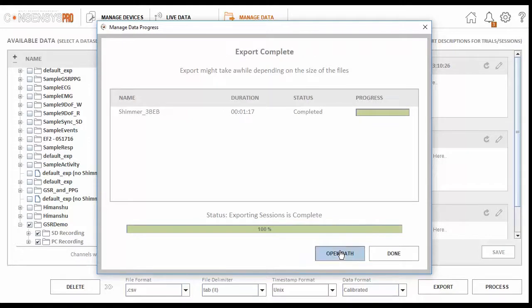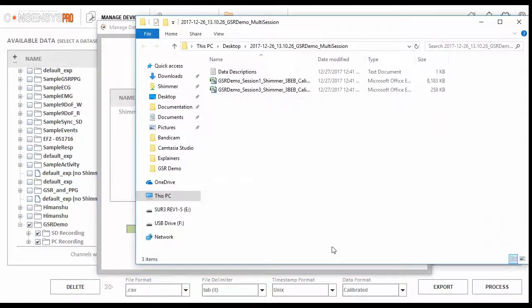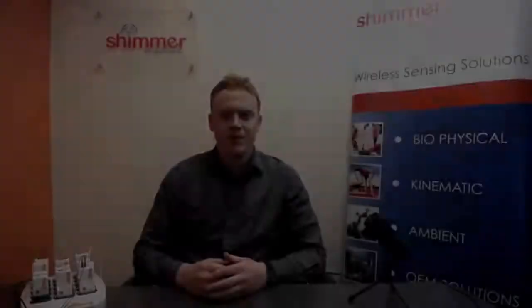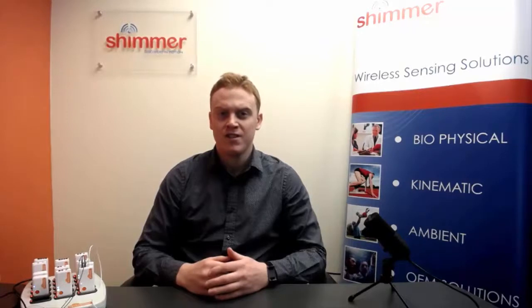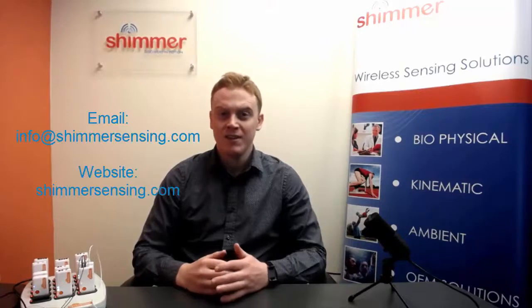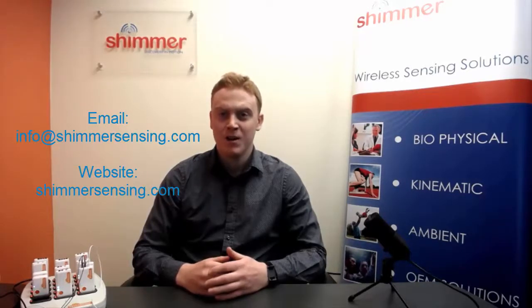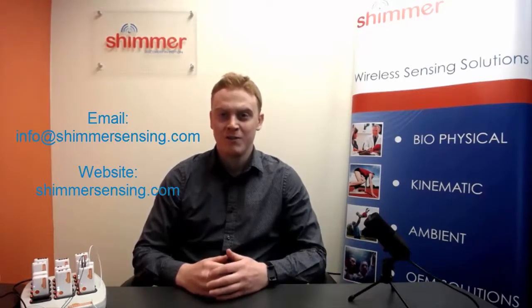Finally, we can see the data has been exported and is available in the local folder on your PC. So that concludes our demo video on collecting GSR and PPG data with the Shimmer3 GSR Plus Sensor and the consensus software platform. We hope you found this video beneficial. If you have any questions about the sensor or the data collection process in general, please email us at info at shimmersensing.com. We look forward to hearing from you.